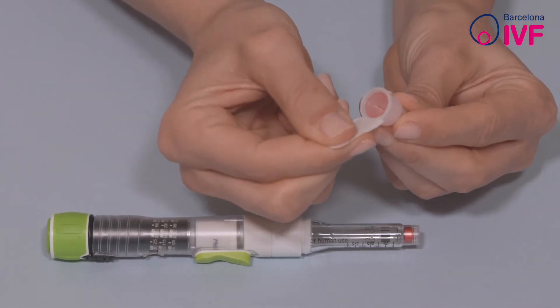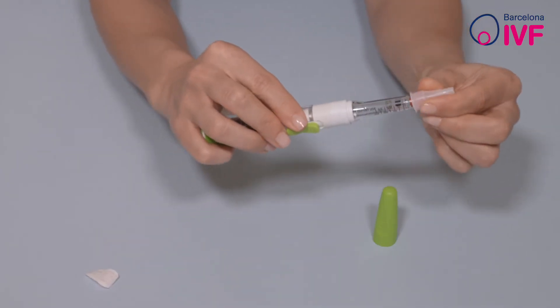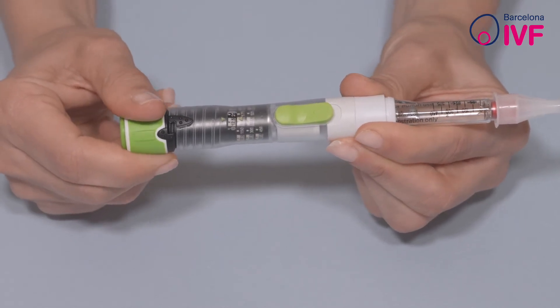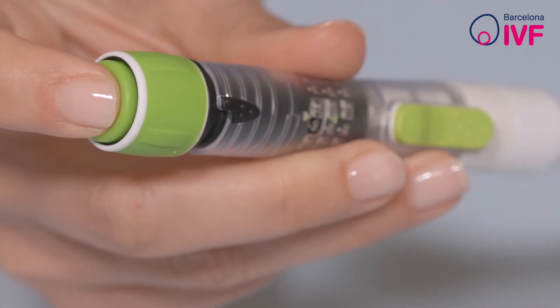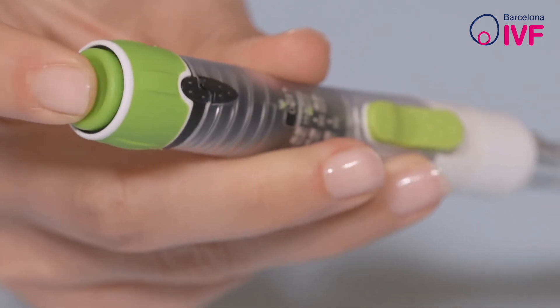Turn the knob on the back of the pen clockwise until the dose to be injected as prescribed by your doctor appears on the display. If you set the pen for more than your prescribed dose by mistake, you can go back by pressing on top of the pen like a ballpoint pen.